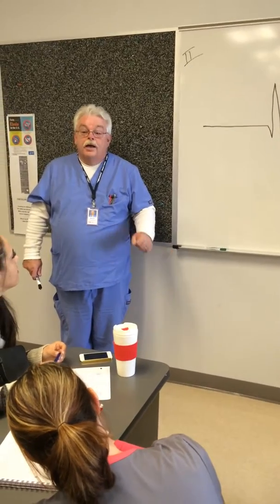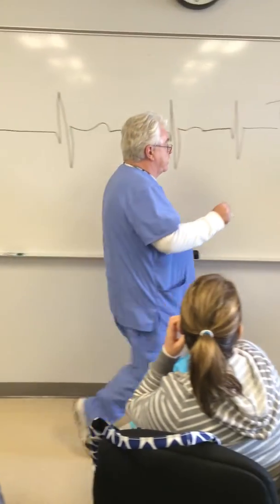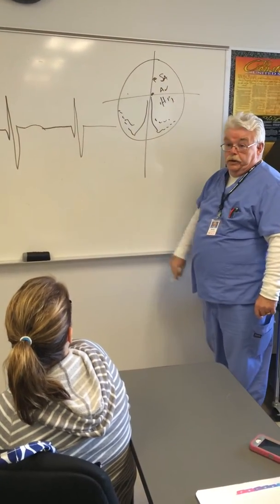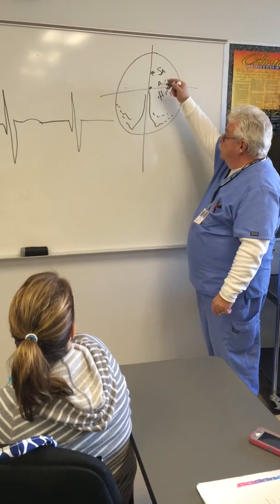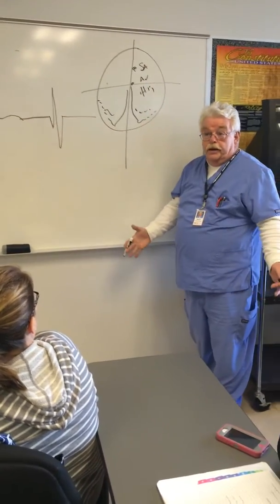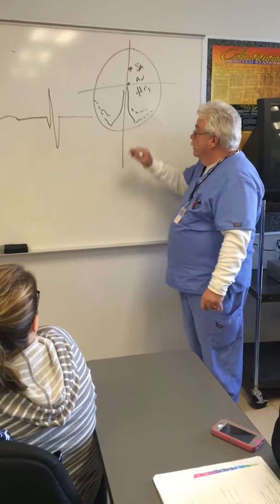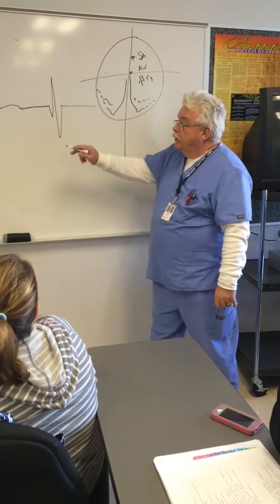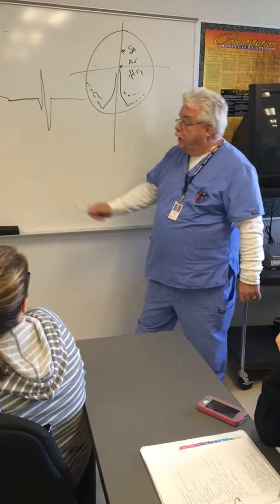Junctional rhythm: the impulse to fire, instead of arising from the SA node where it should be, is arising from the AV node. This is one of the backup pacemakers. The SA node is sleeping. The heart says, I need a beat. The AV node goes, okay, and boom, it gives you a jolt. But because you woke me up and annoyed me, I'm not giving you a P wave.